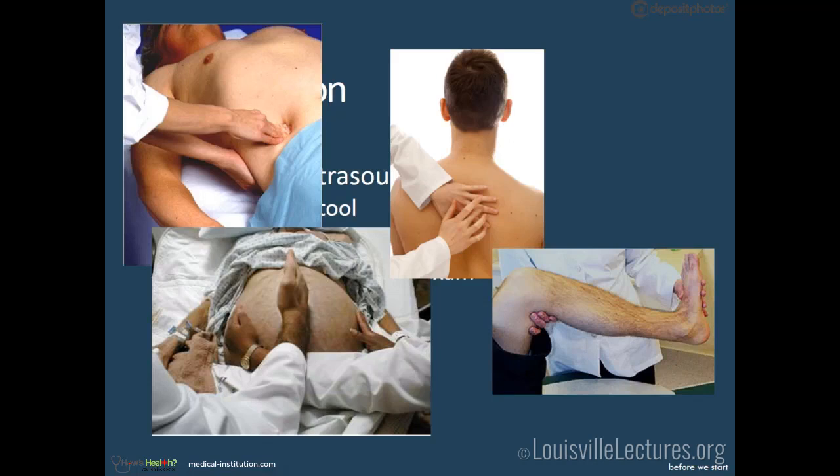Homans' sign is for DVT. I've never seen anyone actually perform a Homans' sign for DVT, but we do order duplexes all the time, and that's something we can do ourselves at the bedside. These are physical exam maneuvers that ultrasound can help characterize as an adjunct.